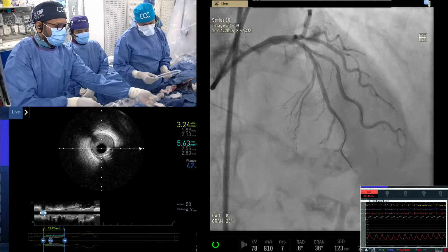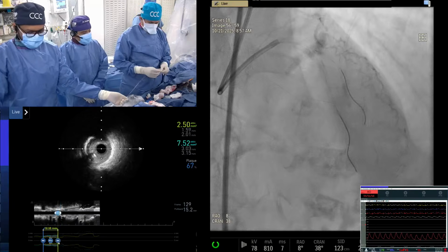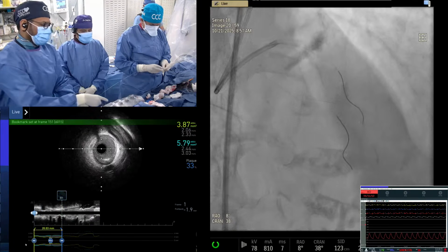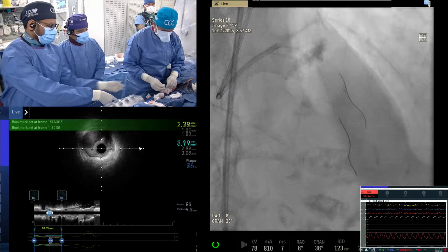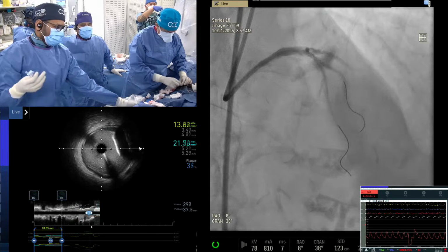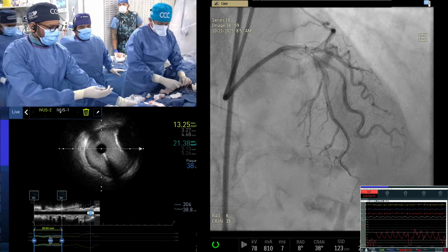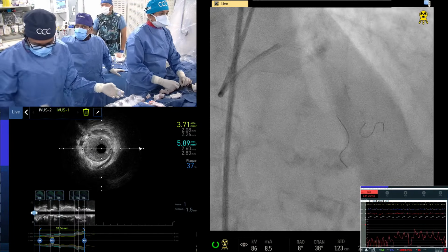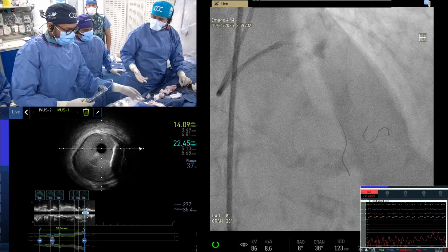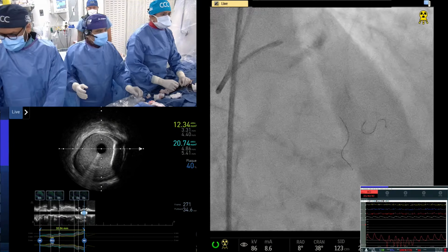And I think the cutoff is usually the stent to vessel ratio of 1.16 has been ideal. We learned from the data of our multi-links and so. So I think I would not go beyond. People do say, the Synergy team, BSC will say, or others, that you can increase the stent to 1.5, 2 millimeter. No. So in this particular case, if the left main distal is about 4.2, I'll put a 3.0 stent and then you can dilate up to 4.0. And I think there is no comparative data difference between two of them. All 3, 4 of stents.